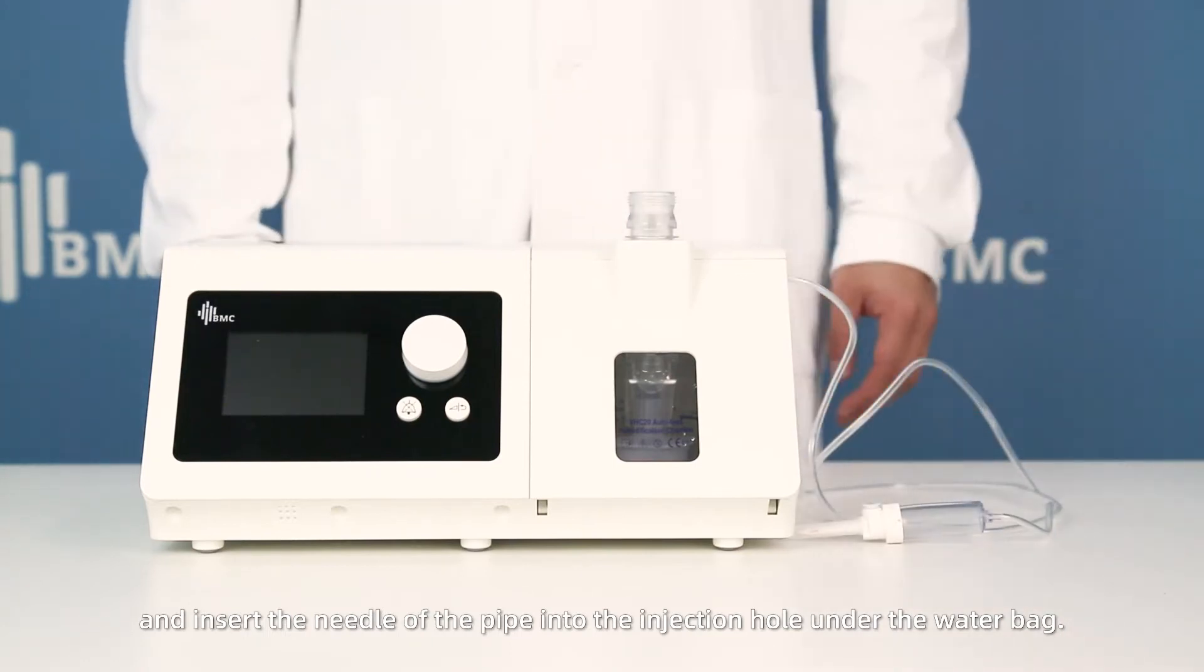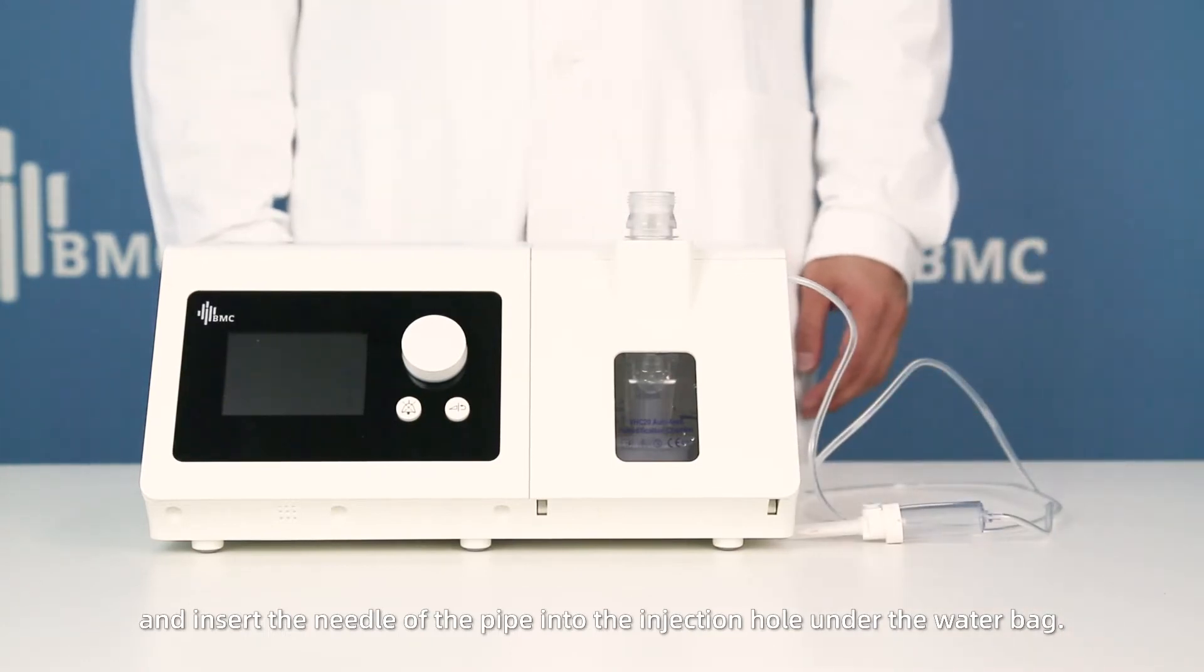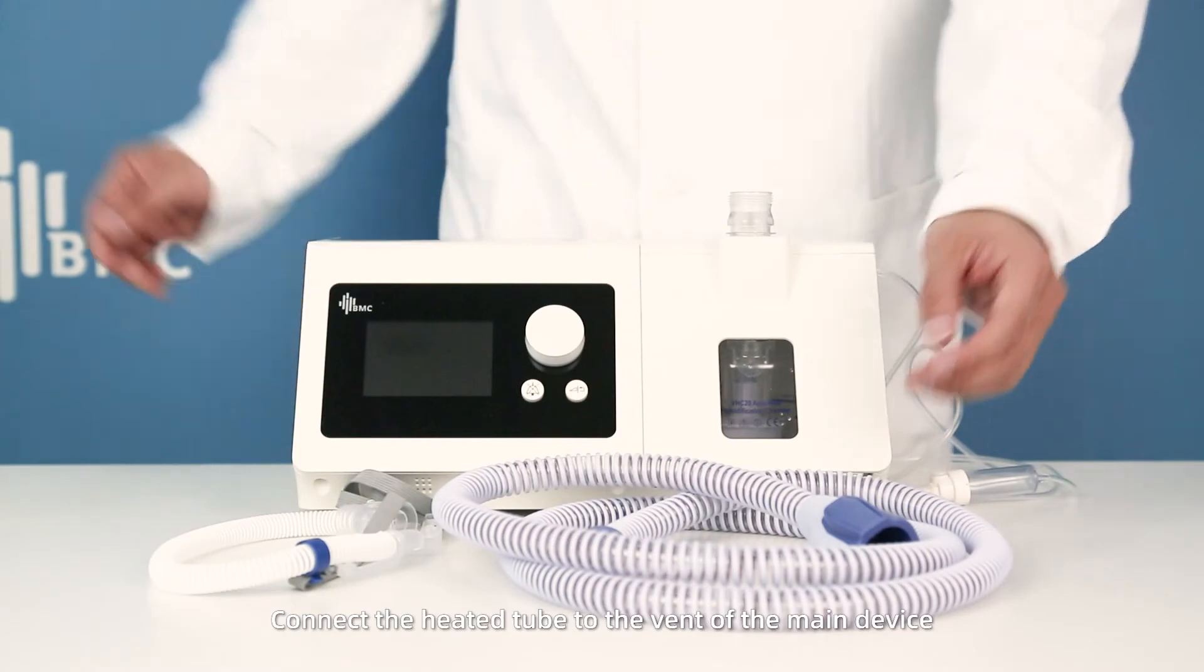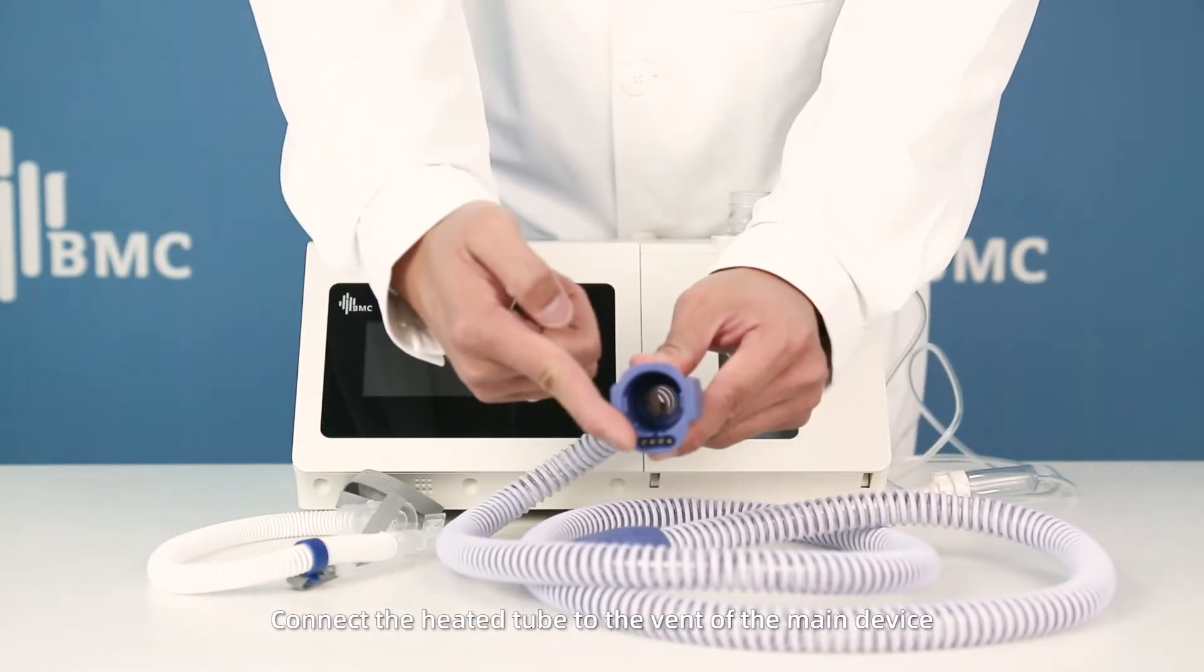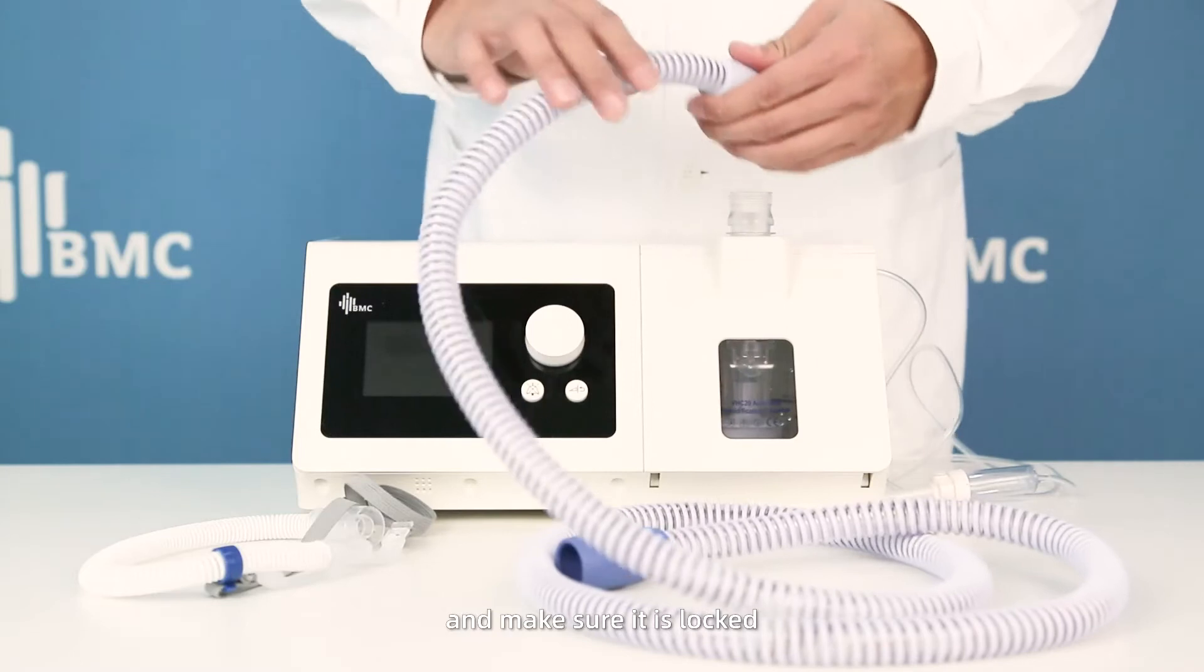Insert the needle of the pipe into the injection hole under the water bag. Connect the heated tube to the vent of the main device and make sure it is locked.